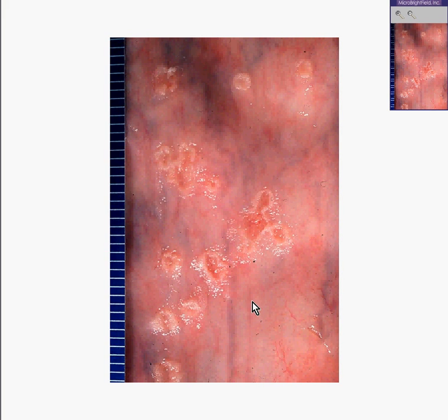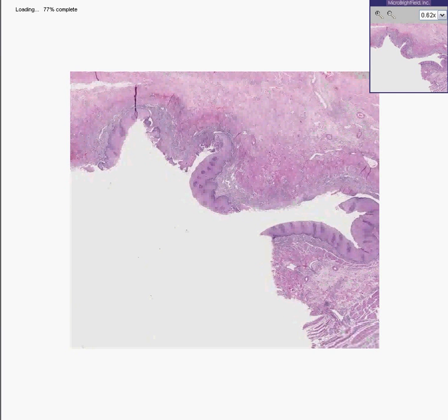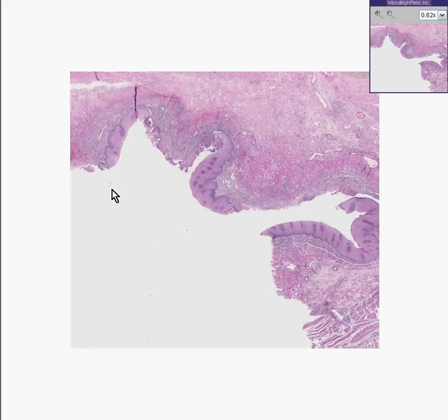Well, if you saw this lesion on a person's lip, you'd probably call it herpes without even batting an eyelid. Only in this case, it happens to be in the esophagus. This is herpes esophagitis. And it looks very much like it would look on any other squamous surface.